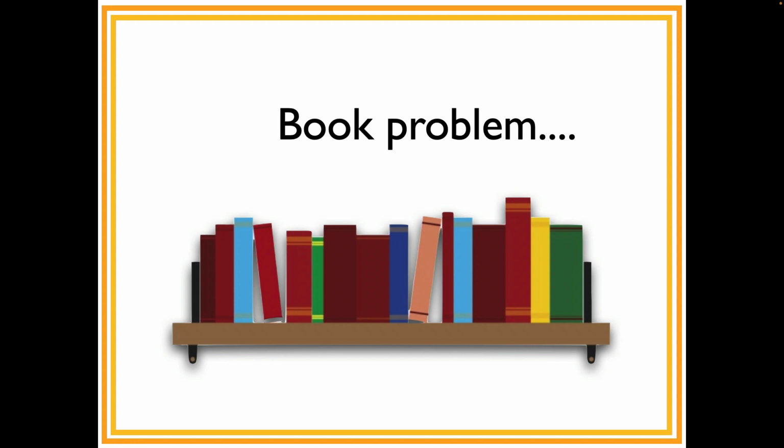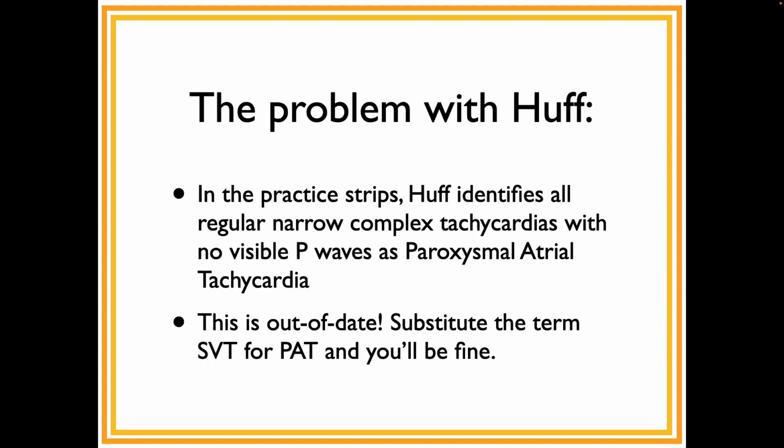Now, there's one problem with that. Wait, I just had a quick question about the answers in the Huff book, how they're always so precise with their heart rates. Are we just supposed to get in a ballpark? Like if you're getting within 5 or within 10? Within 10 of those, you're good. Is it possible to get that? Yeah, it is, because you know how we do the boxes method, there's a small boxes method.